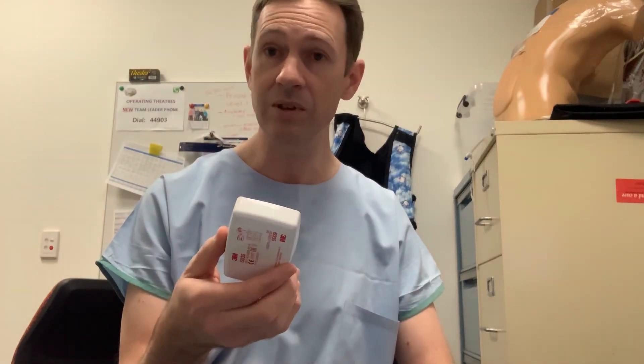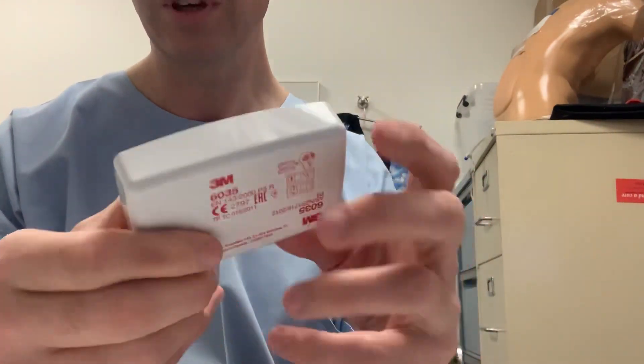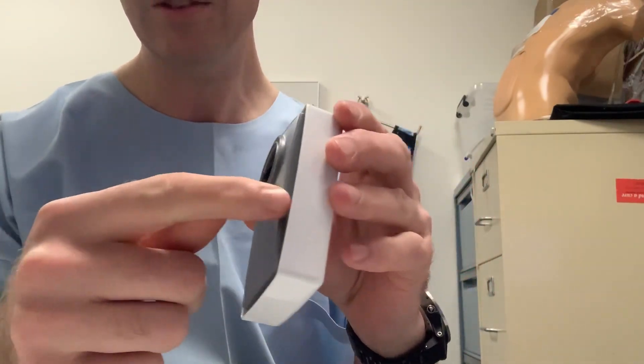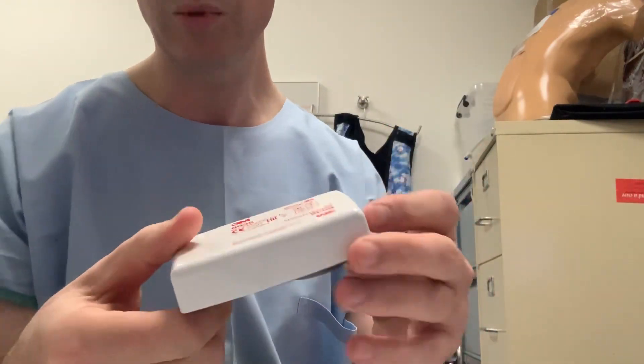This is what 3M calls their pandemic or medical filter. Close up, you can see there's a plastic housing completely covering the filter. Inside is a HEPA filter, a bit like an HME. The inhaled gas goes in the sides, around, and then out. This is reusable, according to 3M, for the duration of a pandemic wave.